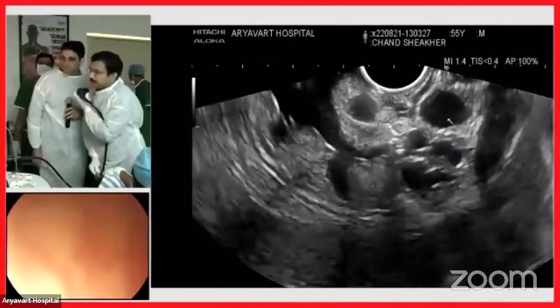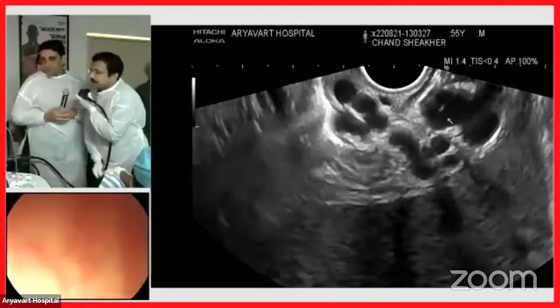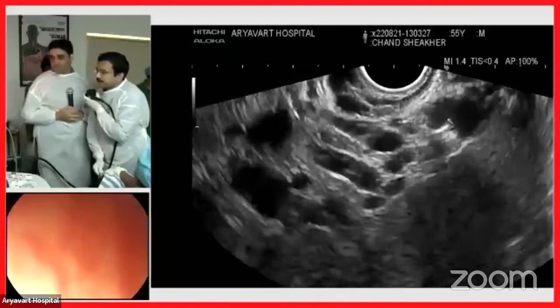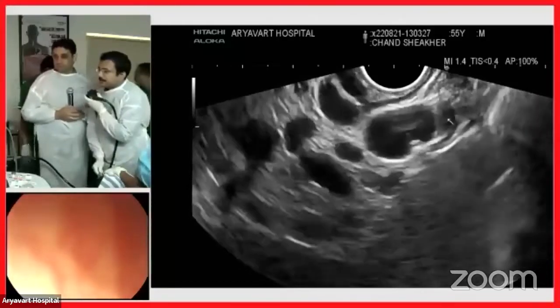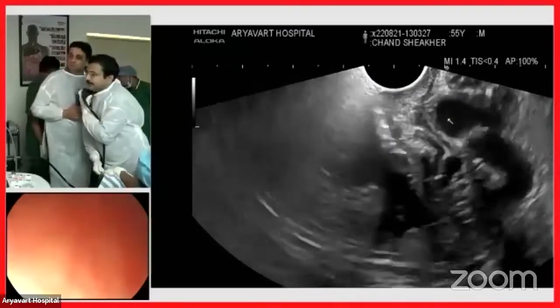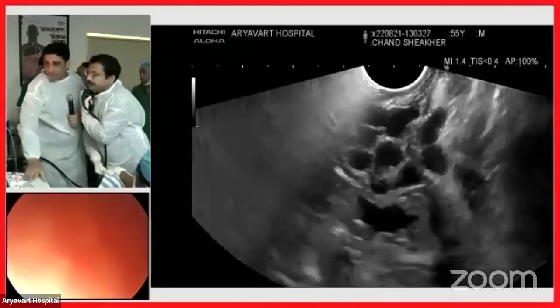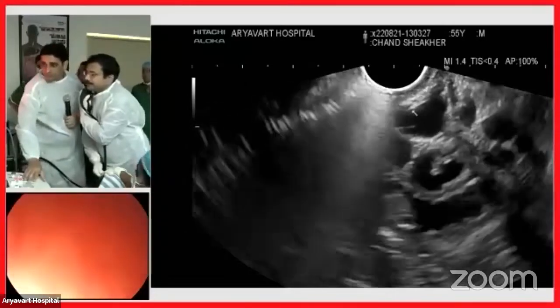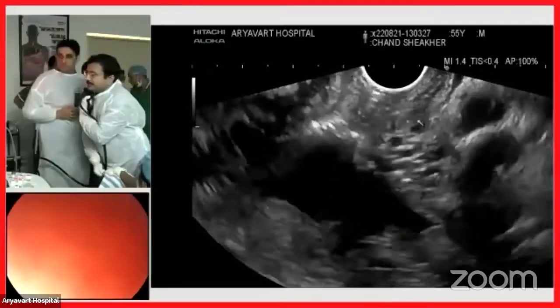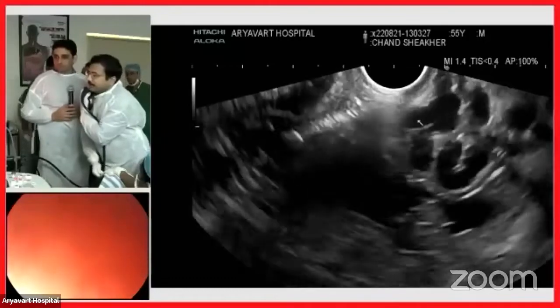These are paragastric collaterals. As we trace the collateral outside, you can see it is continuous and coming to the splenic hilum where there are multiple collaterals. Once we start going inside, we can see this paragastric collateral is communicating — and here is the part where this particular vessel is actually communicating with those small varices I just showed you. Do you agree, Dr. Kapil?